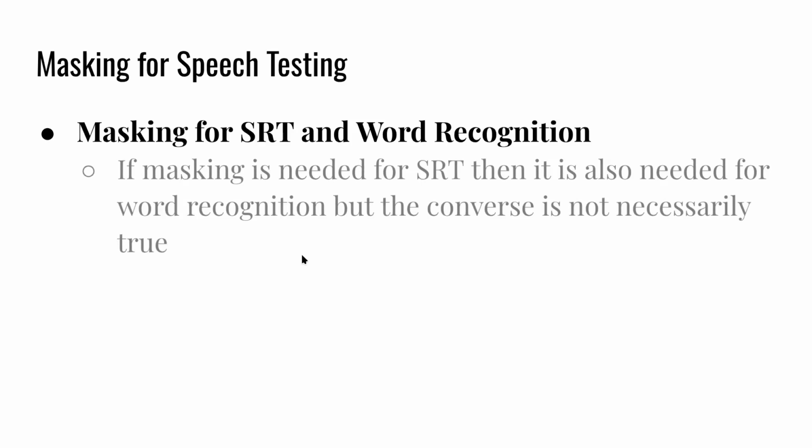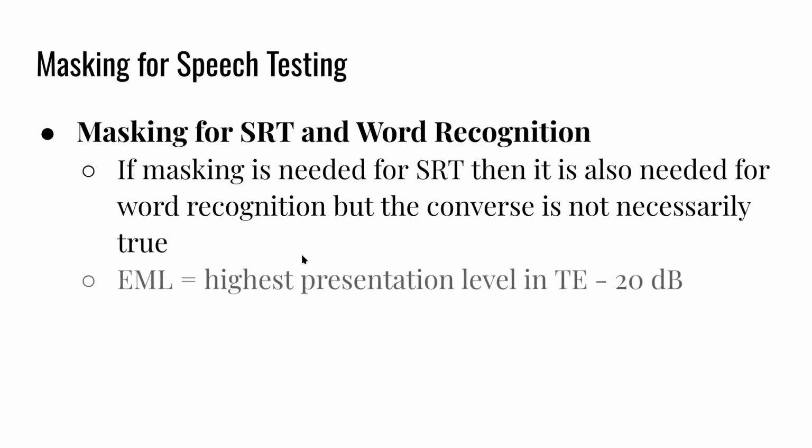So, masking for SRT and word rec. If masking is needed for SRT, then it is also needed for word recognition, but the converse is not necessarily true. If masking is needed for word recognition, it doesn't mean you need it for SRT.